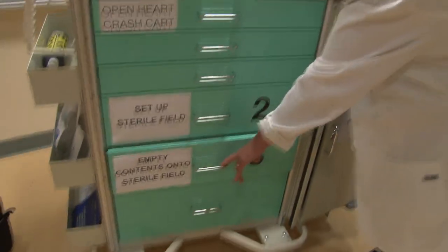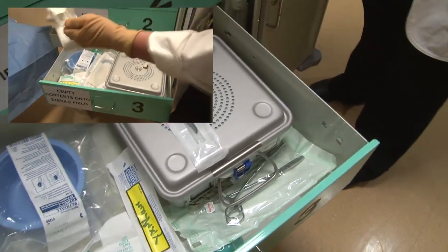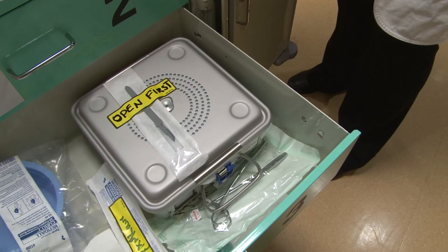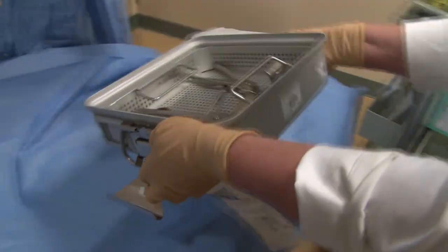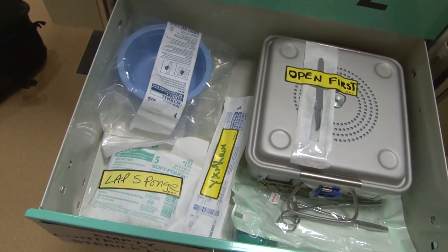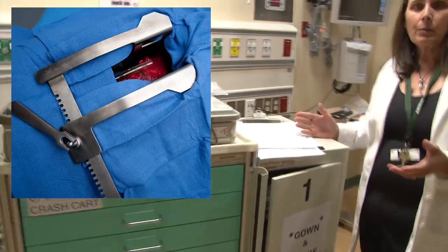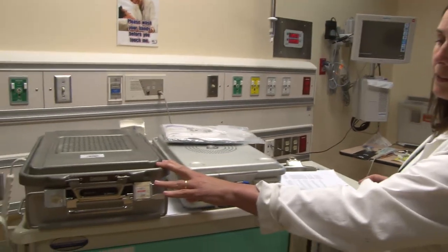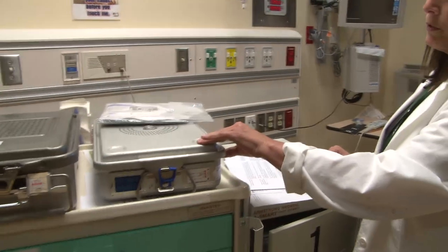The third step is handing over everything in drawer three to the surgeon in the sterile field. The scalpel or blade is on top of the small instrument tray and must be opened separately as it could not be sterilized in the tray. Open that first as per the directions on the box. After he has the scalpel, hand off the inside of the little box to the surgeon. Now the chest can be opened. While they are working, open the rest of the items in drawer three and place them onto the drape without contaminating anything. Once everything in drawer three is emptied onto the field, the retractor is in the patient, the chest is open, and immediate defibrillation or relieving of tamponade has started. Then go back to the top of the cart, look at the large instrument tray, and ask if they're ready for it. The defibrillator pads on top of the tray can also be thrown onto the sterile field when requested.